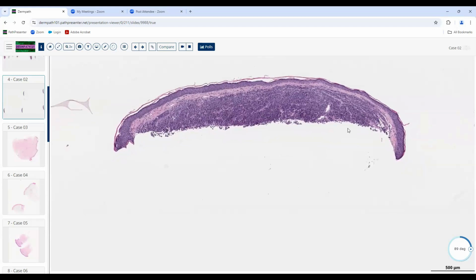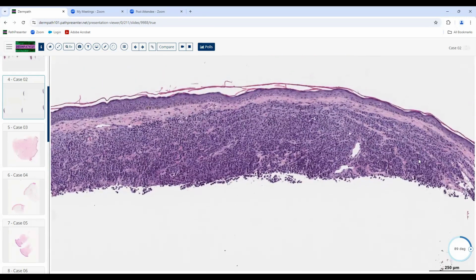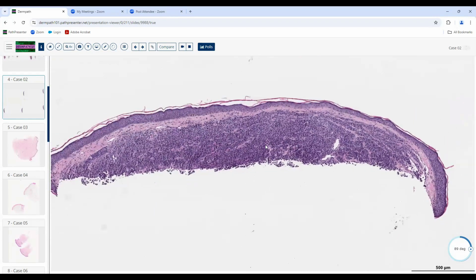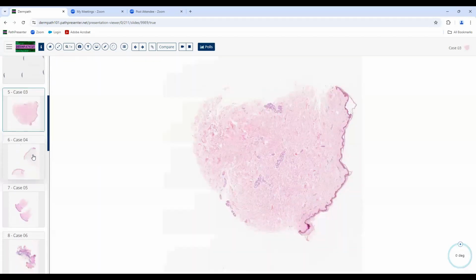They did a shave biopsy, which is kind of a no-no. I mean, this lesion is hard enough to diagnose as it is. When you shave it, and that's all we have to look at is something like this, it can be extremely difficult. It can result in an erroneous, false, wrong diagnosis. I suspect they probably gave us a history of melanoma and something like this, but nevertheless, it'd be better to take an incision or a punch biopsy if you're dealing with that to make sure you can kind of look at the whole thing.